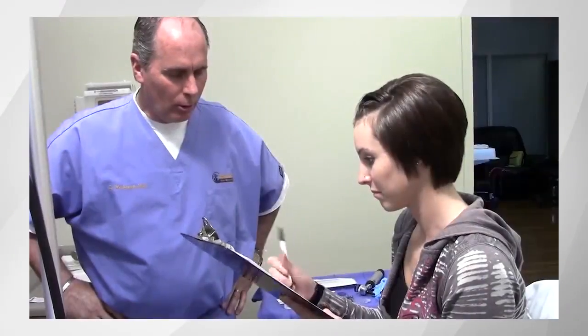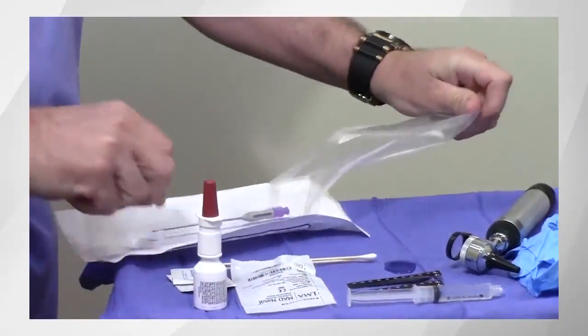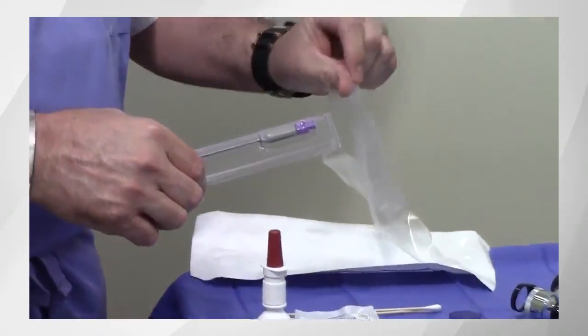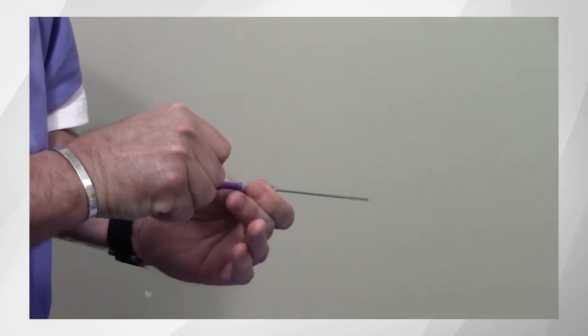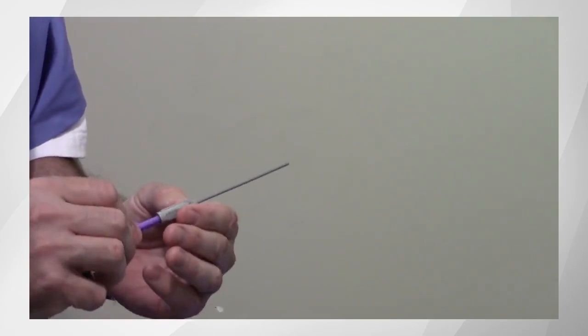After explaining the procedure and obtaining informed consent, inspect the SphenoCath and packaging. Pull the catheter out of the package and inspect the catheter. Verify that there are no rotational defects by ensuring that the deployed inner catheter is spatially aligned with the directional indicator on top of the hub. Retract the inner catheter by pulling the gray and purple hubs apart.